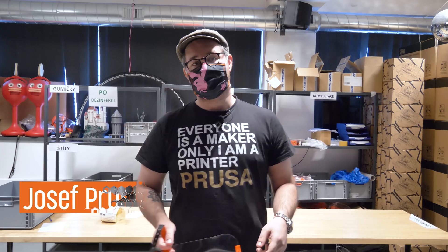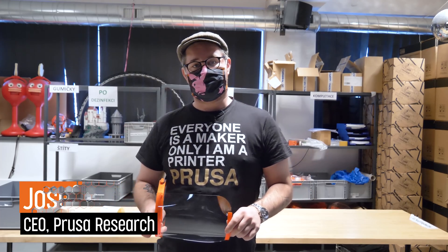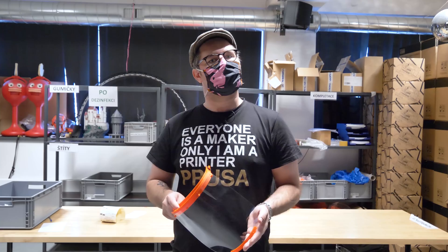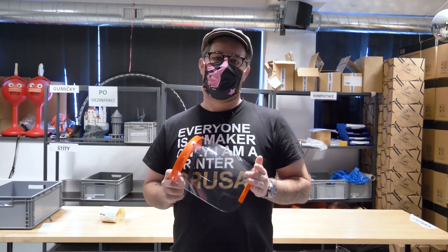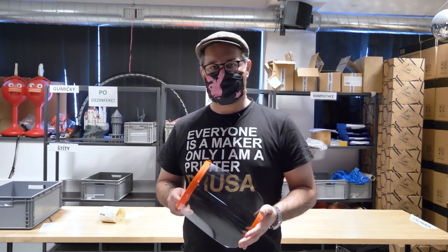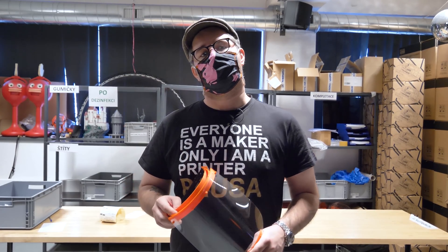Hi guys, my name is Joe Prusa. Unfortunately we are making this video in the middle of a pandemic, but I want to tell you something about how we make personal protective equipment shields, which are in great shortage all around the globe, and how we manufacture and distribute them here in Czech for our medical heroes. So now let's take a look at how we make them on our print farm.